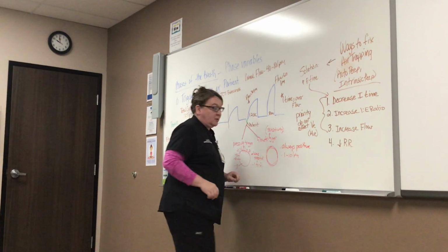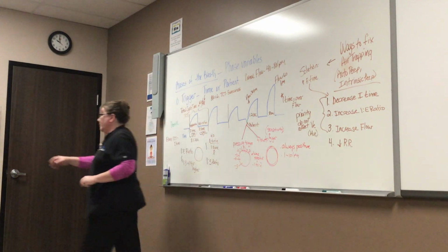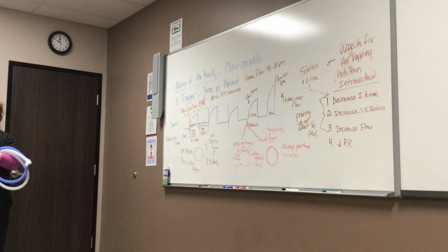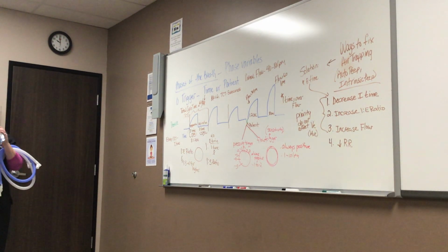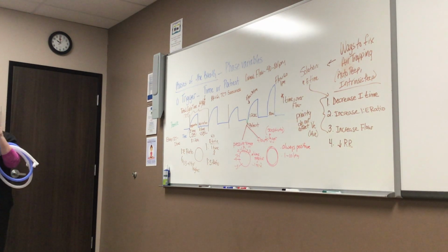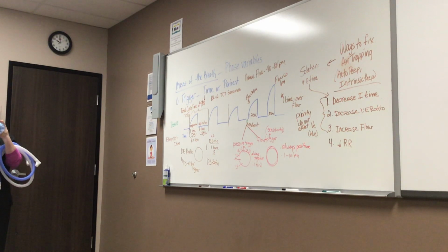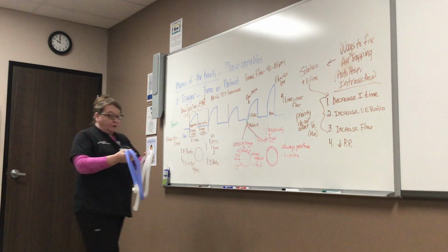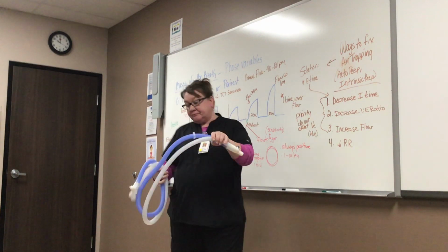I'm going to use my vent circuit to show you how flow trigger works. Everybody write that down real quick. 1 to 10, my little dot, like a bullet. Yes, liters per minute. 1 to 3 liters. Okay, so flow trigger works like this.